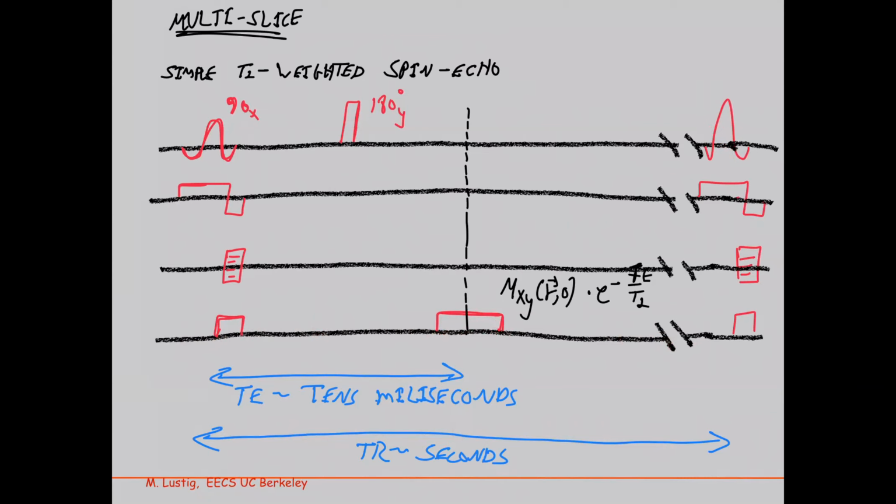That is a very inefficient acquisition, right? Then you do it for one slice, and then you do it for another slice, and then another slice. Whoa, that is super slow. That is the slowest. This is why MR in the 80s was one of the slowest things you could ever think of. Just completely inefficient acquisition.